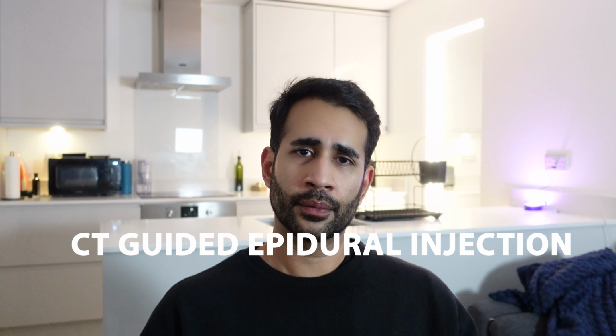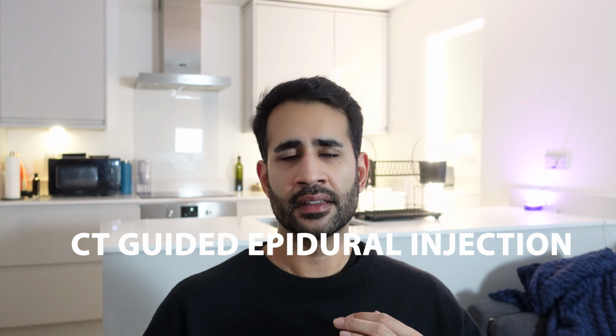Now, firstly, the reason your doctor might have referred you to get one of these procedures will probably be because you're getting some sort of back pain. It's potentially radiating down to your legs. Could be one leg or both legs. You've probably had some imaging done, either a CT or an MRI of your spine, and that might have shown some sort of disc protrusion or a disc bulge that's irritating one of your nerves, and that could be the source of your symptoms. Now, you've been referred to get this procedure done, a CT guided epidural injection.